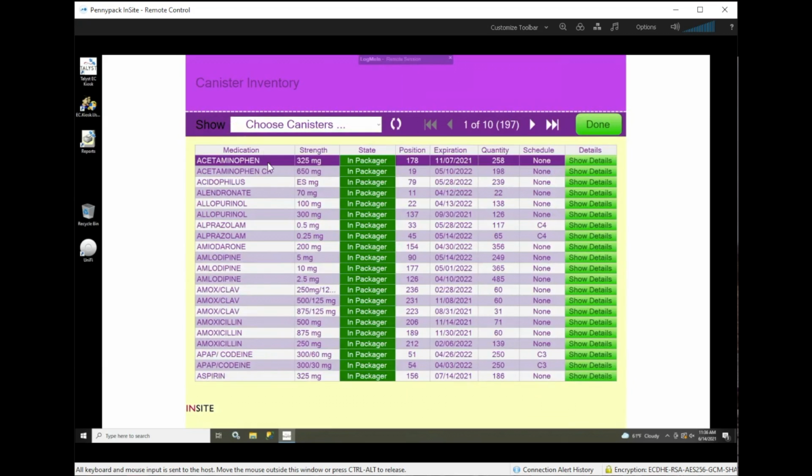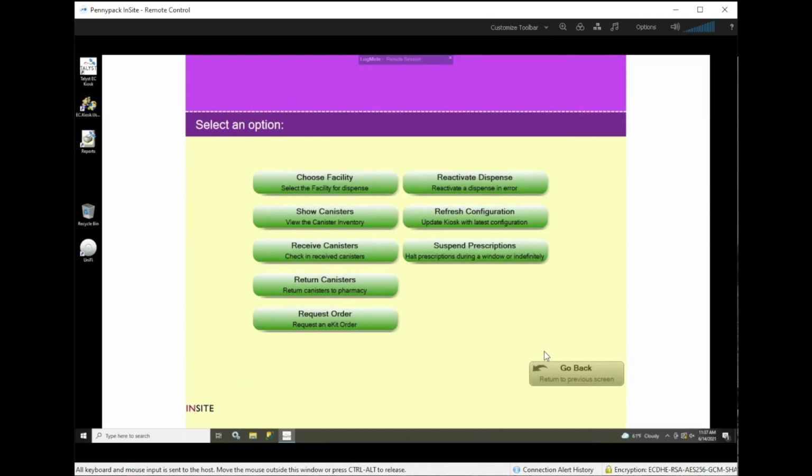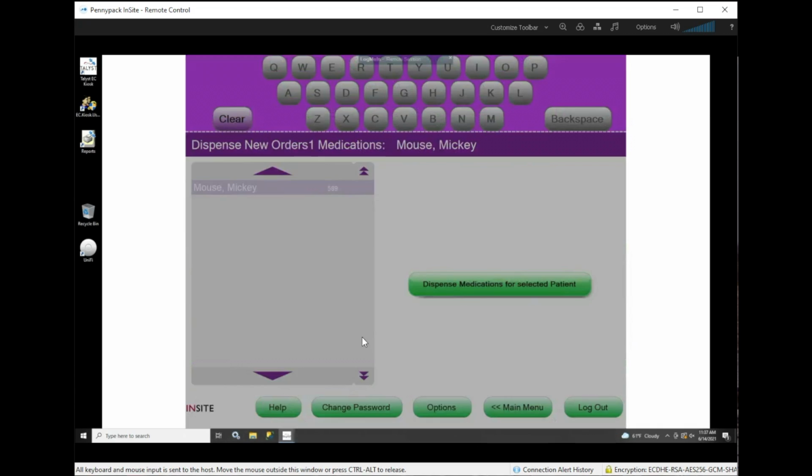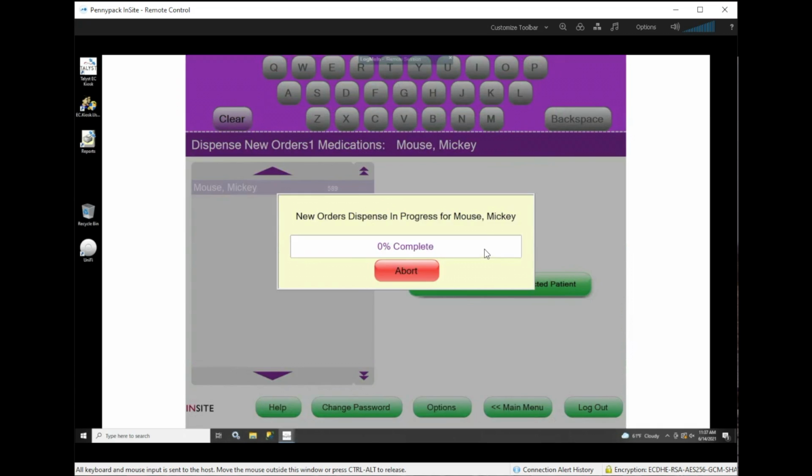So what we need to do, and this is where it's kind of really frustrating, you have to look through the entire machine without any hints as to where the canister is. Now, my suggestion is always to look in the big front cabinet because that's where most canisters are, and you're just going to look for a canister that is sitting on a base but the light is still on, because that's a good indicator of a can on the shelf. Then once you do that, you can go back to options, show canisters, and make sure that the can is read by the machine, and then you can continue dispensing.